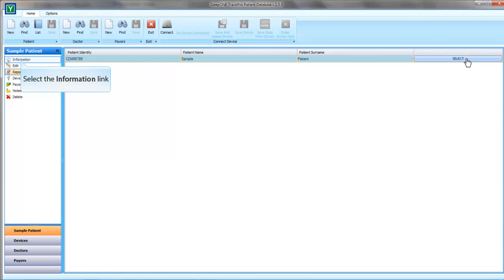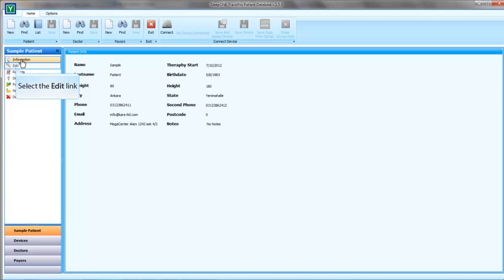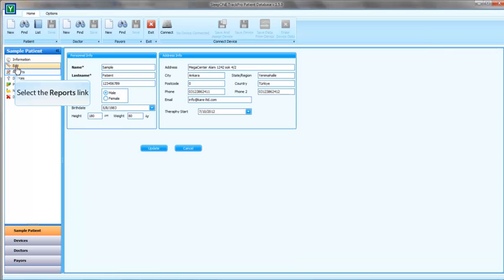Now let's go to Information tab to see the information about the patient we have selected. Basic patient information is stored in this field. If you want to change these, you have to go to Edit tab. In the Edit tab, you can change the basic information about the patient.